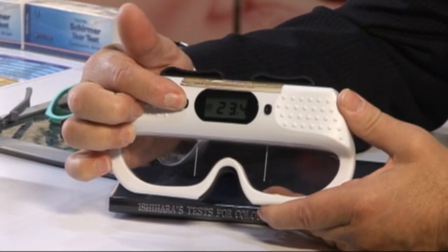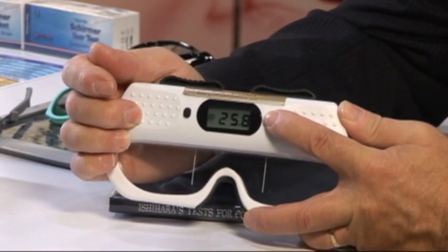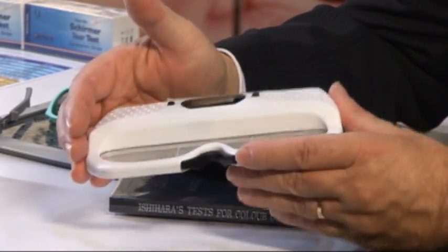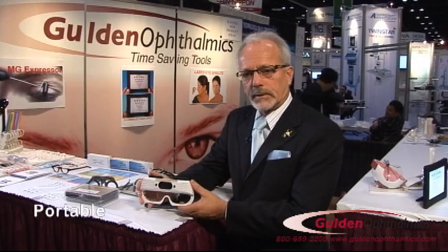You press the right button it gives you the right measurement, press the left gives you the left measurement. The best part about this is that when you finish and you place it down on the counter it automatically shuts off. It's very versatile, easy to use and portable. You can even slip it into your lab jacket, unlike most digital PD rulers.